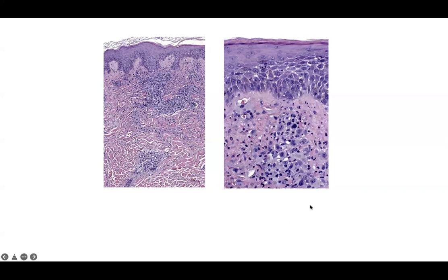Some of these cells look mildly enlarged; there may be more cytoplasm than you're used to seeing for lymphoid cells. There's some overlying spongiosis, so this is impossible to get on H&E alone — you have to have at least some clinical context as well as process-of-elimination answer choices to get it correct.